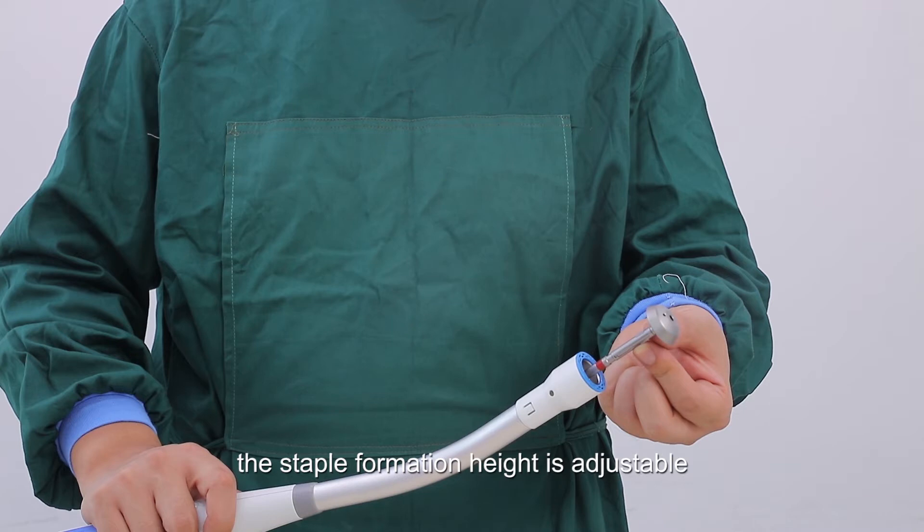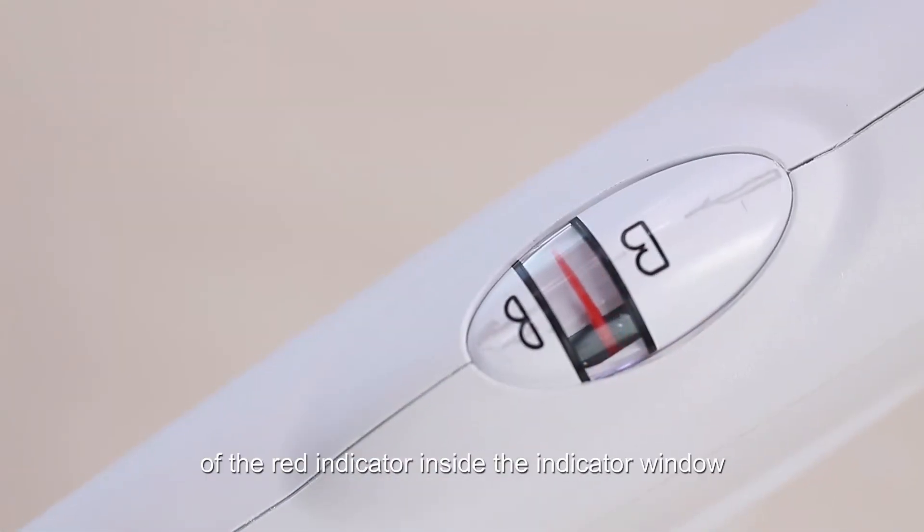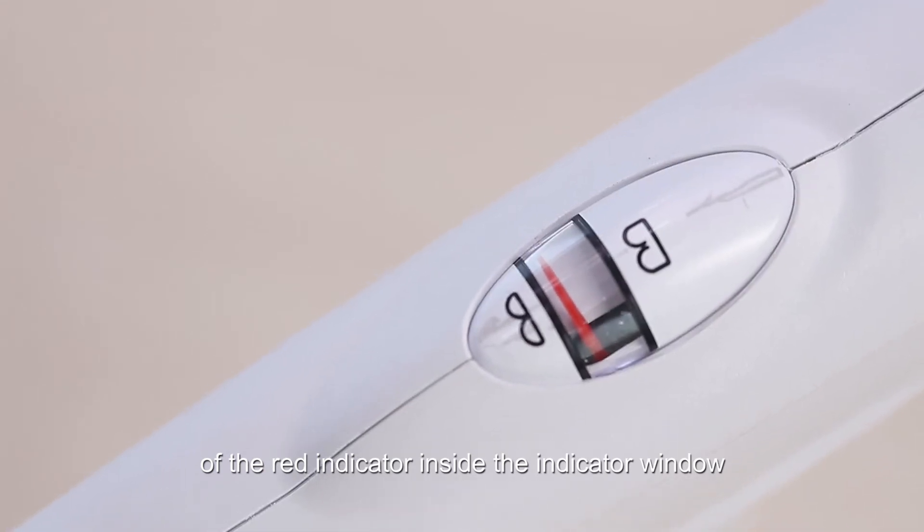The staple formation height is adjustable, so the most suitable height can be chosen depending on the thickness of the tissue. The height can be adjusted from 1.5mm to 2.2mm, according to the position of the red indicator inside the indicator window.